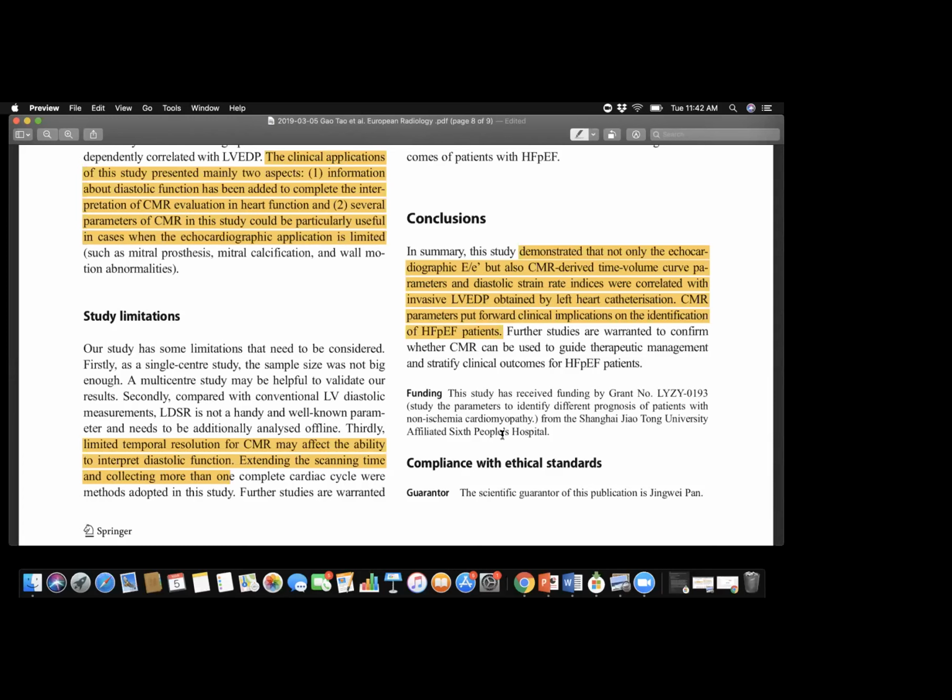And there's also E to E prime in echocardiography. It's load dependent as well. And again, the windowing is a major limitation that we don't have in CMR. So I think taking everything into account, it's a great addition using these parameters with MRI.